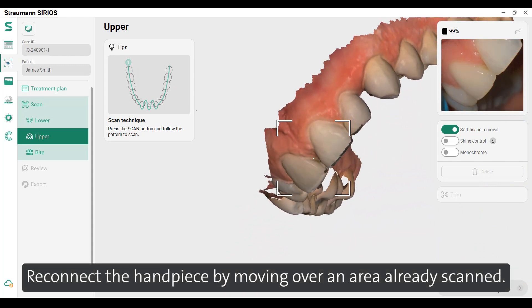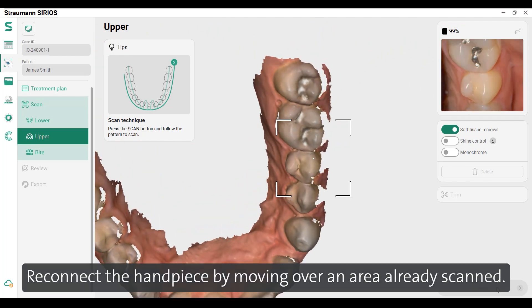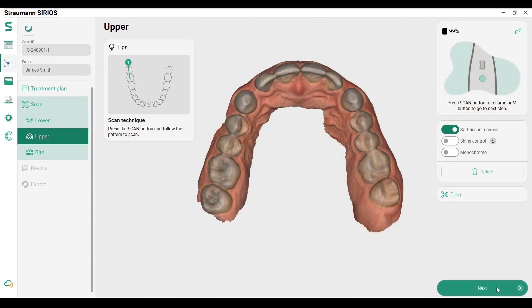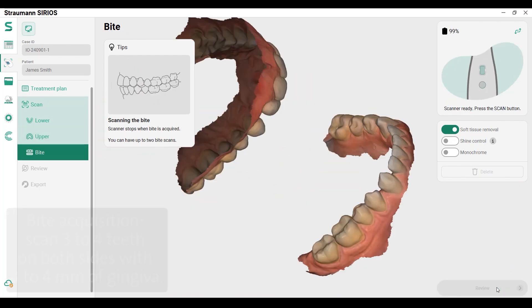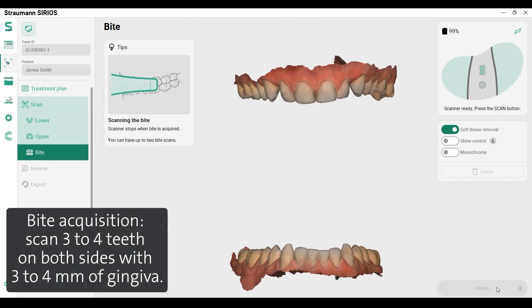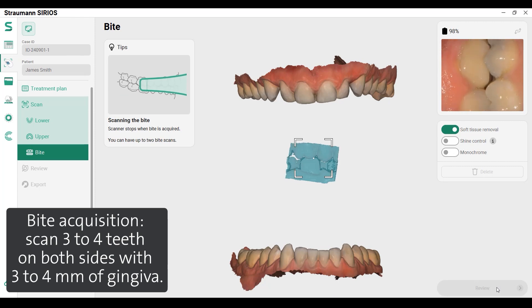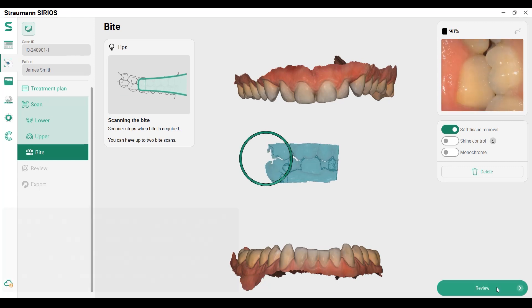Reconnect the handpiece by moving over an area already scanned and review your scan. For bite acquisition, scan three to four teeth on both sides with three to four millimeters of gingiva. Once the software has enough data, the scanner will stop.